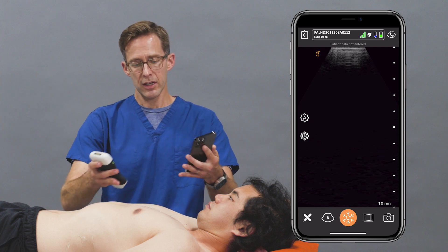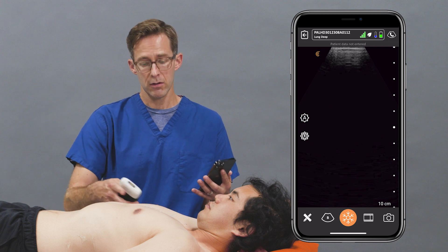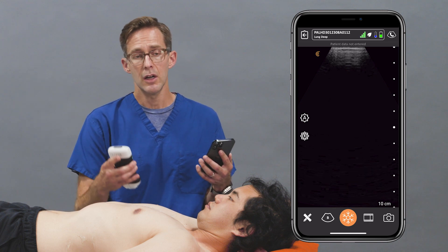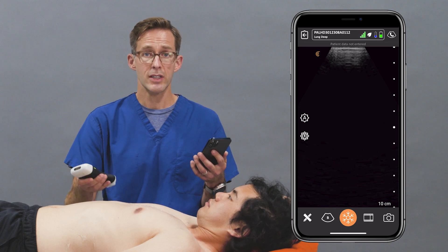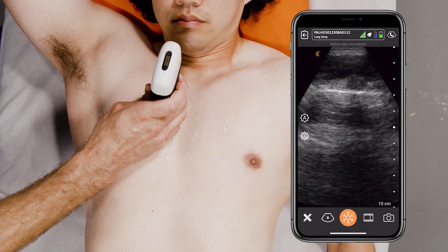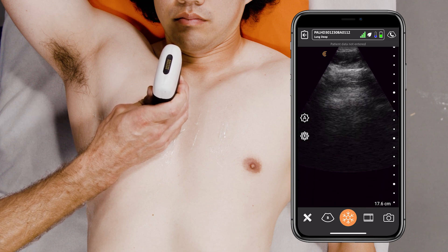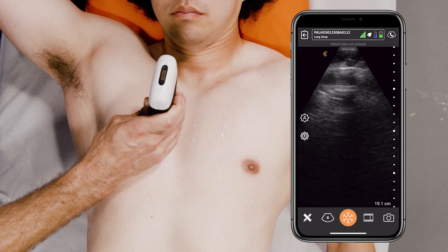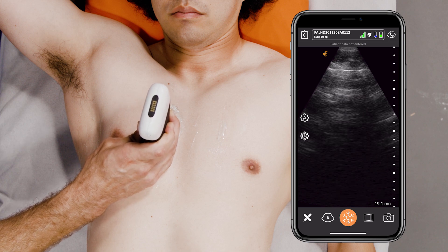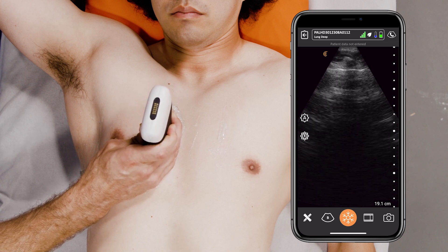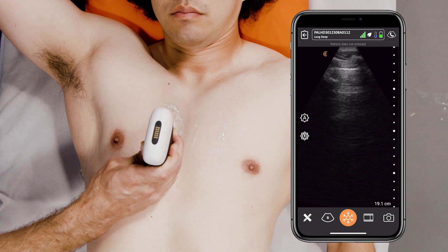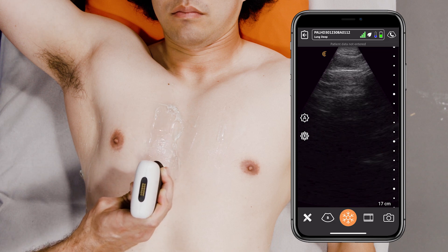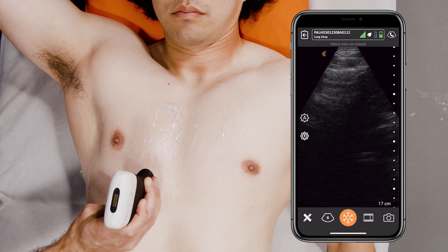You have to break up the scanning area into anterior, lateral, and posterior viewing. We're doing this for three reasons: we're looking for pulmonary edema called B lines, we're looking for consolidations, and we're looking for pleural effusions. I start anterior once again, going deeper — setting the depth to about 18 to 19 centimeters. In this healthy individual we're seeing A lines, these horizontal lines that are normal reverberations in the lung. Sometimes ribs can obscure visualization, but overall we're seeing healthy A lines, moving slowly anteriorly toward the feet, looking at the lung parenchyma to make sure we're just seeing A lines.